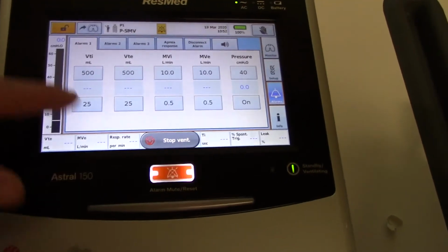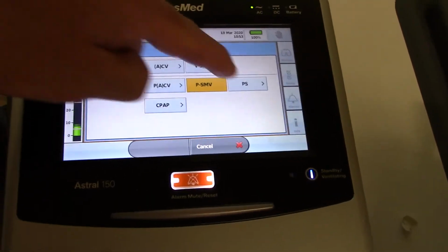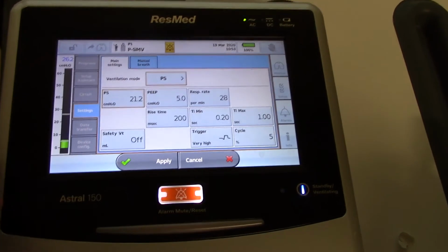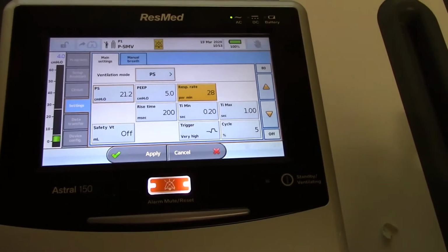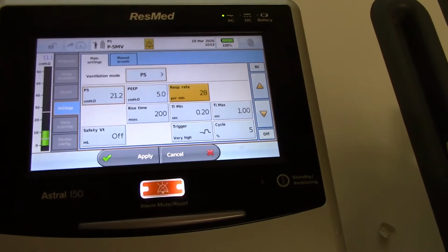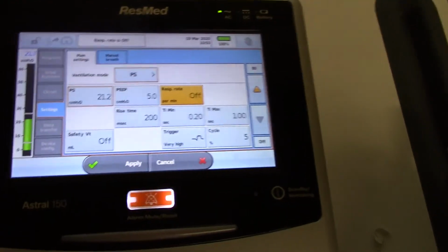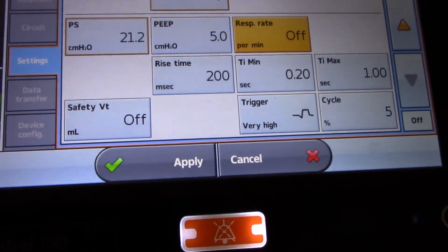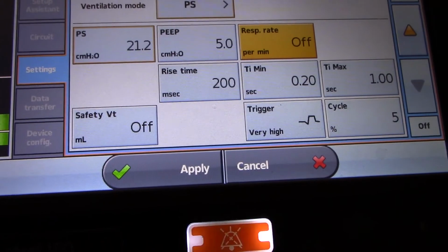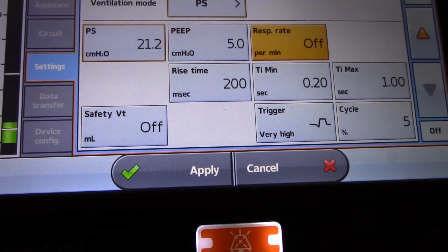One other thing we're going to look at here is CPAP pressure support. When you go to CPAP pressure support, you see there are some other things in here like rate. When we order CPAP pressure support on a patient, we're going to mimic the servo, and that's what we're going to try to do here as well. So we do not want a backup minimum rate, so we'll turn our respiratory rate off. Safety tidal volume as well, which really resembles volume support, we're going to have off as well. So off the rate, off the safety volume.